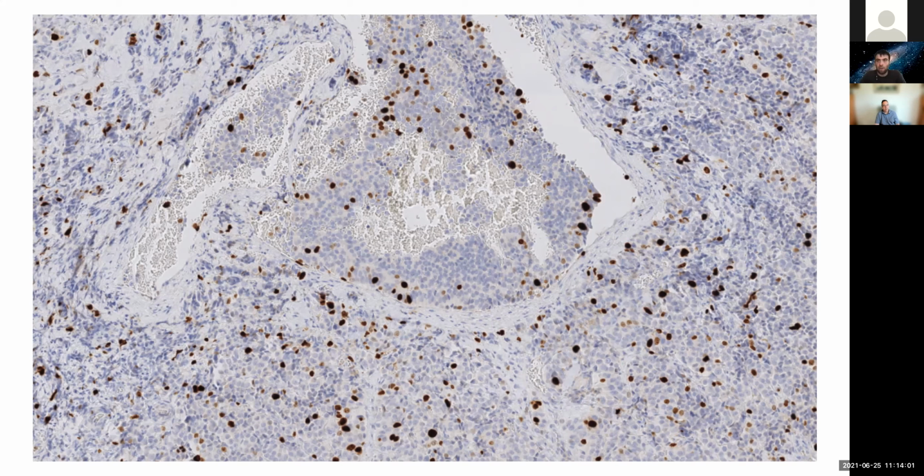Yes, we currently only focused on the one class problem. So basically determining if the tissue is tumorous or not, so cancerous or not. So we are currently exploring translating this problem into these neuroendocrine tumors that I'm showing you now. So in this case, we'll have 3 different classes of cells. So we'll be able to determine also the ability of such methods to differentiate multiple classes. I hope that I answered partially your question.